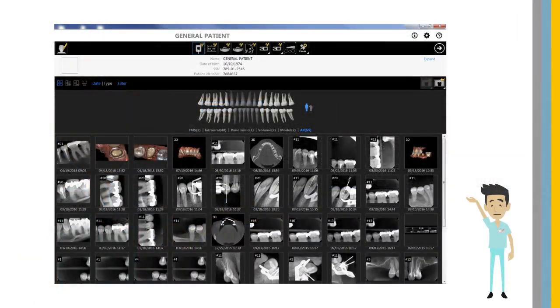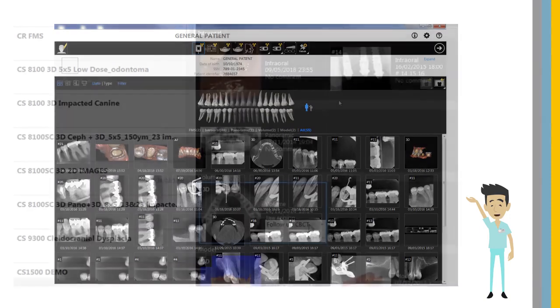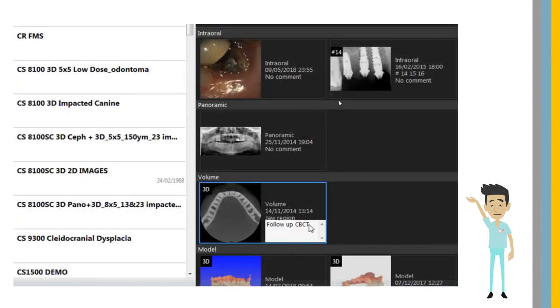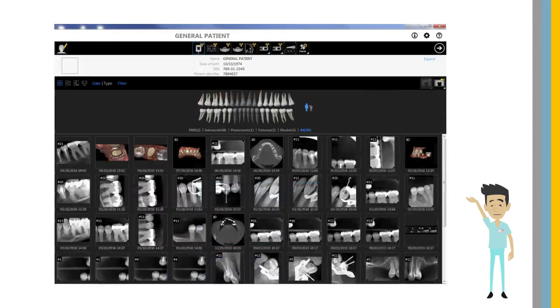You can attach documents, images, and videos to patient records. You can access image acquisition, add comments, share, print, and export images from the dashboard.